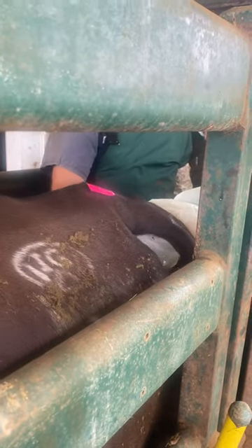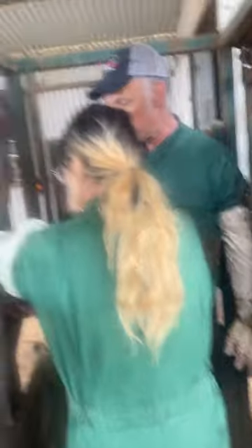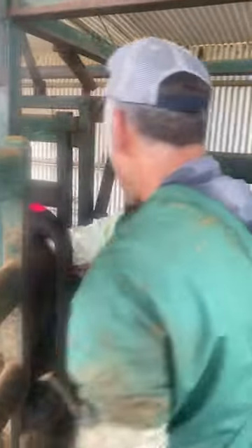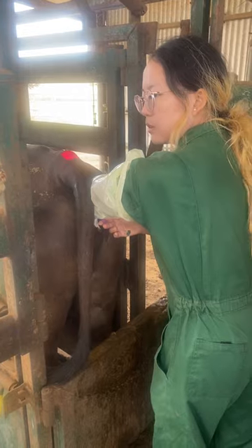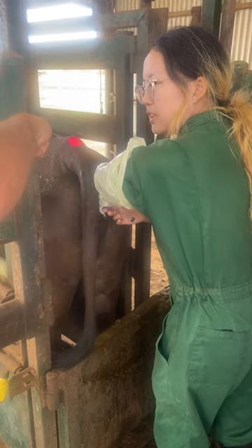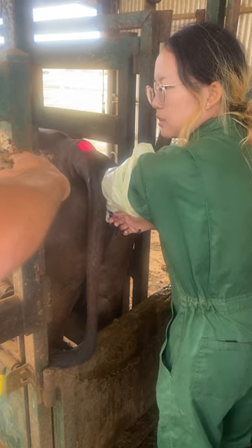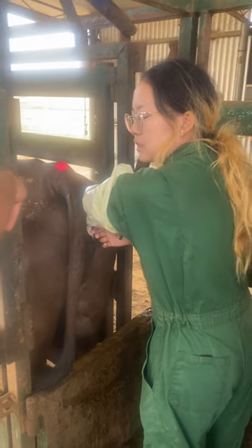Now grab the gun with your right hand, and then as you withdraw it, you should feel it — put a bit of tension on it, maybe step in a bit more because your arm is straight. There you go. Drag that gun out, you'll feel it come out of the cervix. The cervix is like this and the vagina is like this — big vagina, big cows. So as it slides out, you'll feel it suddenly free up so that it can move around, versus right now it's being held like inside a fist, which is the cervix. As you back it out, you can feel the movement. Feel the scratchiness of the cervix, and then with general pressure, slide it back into the cervix.